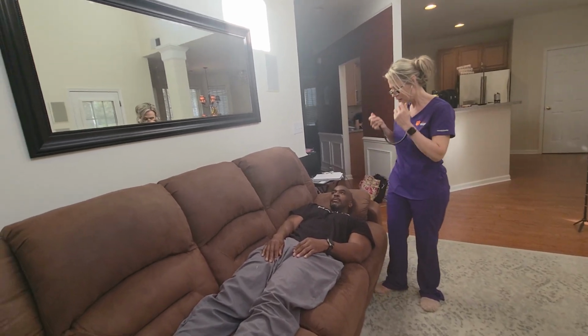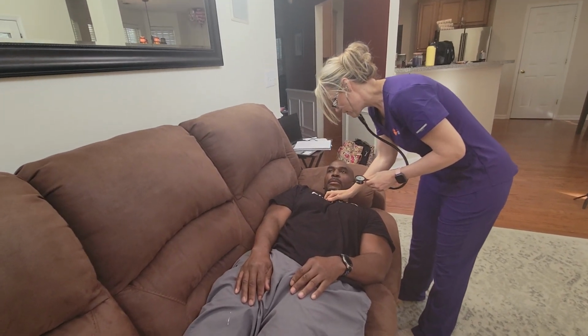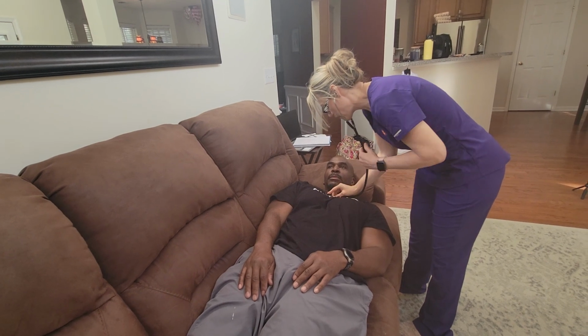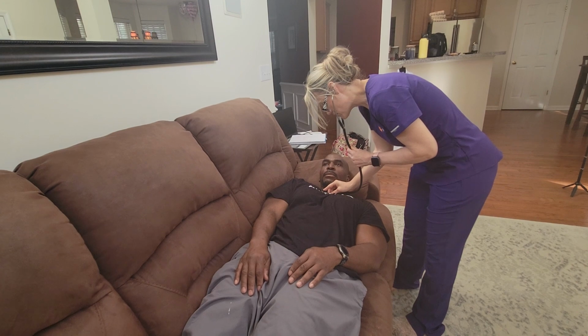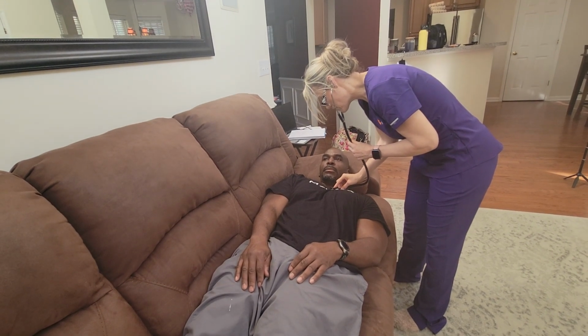I'm going to start by finding the second intercostal space at the right sternal border, and I'm going to listen for his aortic, which is also S2, and on the left sternal border is the pulmonic valve.